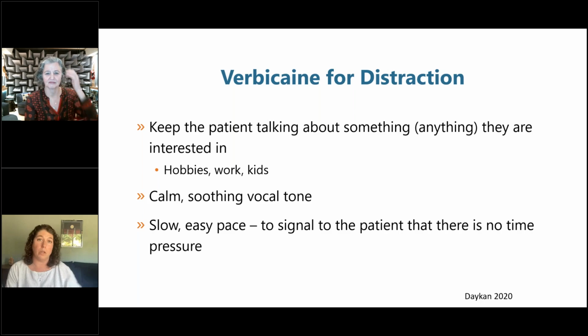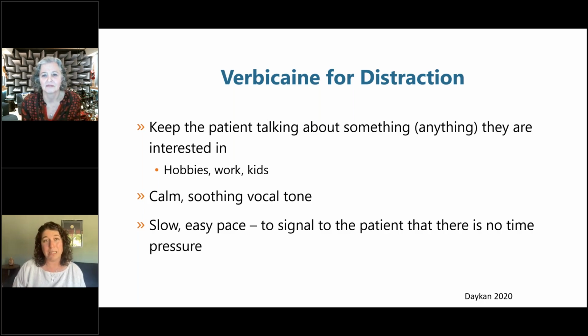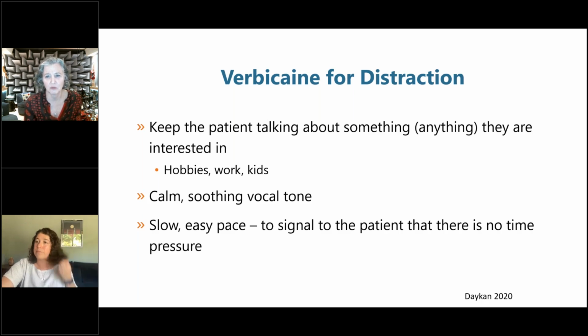So as much as possible, especially for those of you who are newer to doing this procedure, even if you're feeling a certain amount of nervousness or anxiousness, figure out how you can self-modulate that so that at least vocally you're conveying a sense of calm to the client. It's really important with verbicaine, when you're having this conversation that's designed to distract someone, that they want to have a conversation, that you start to engage them in the conversation. And if they don't seem interested in having a conversation about the fact that they're learning to be a pilot, or whatever it is that they love.